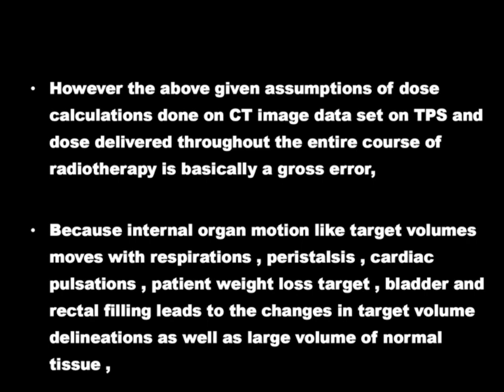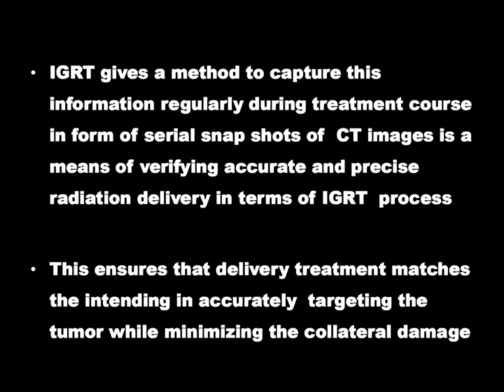So in-room imaging is where you take imaging during the radiotherapy, just before the start of radiotherapy, or in between two fractions of radiotherapy. Usually linear accelerators are equipped with the KV imaging system, and sometimes built-in cone beam CT is a most important requirement for delivering SBRT.